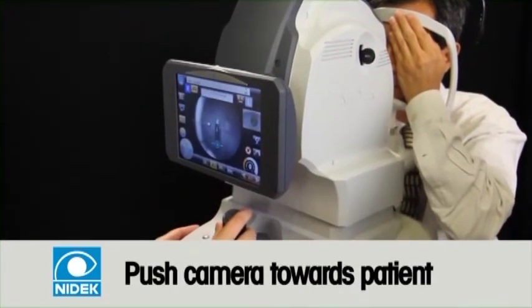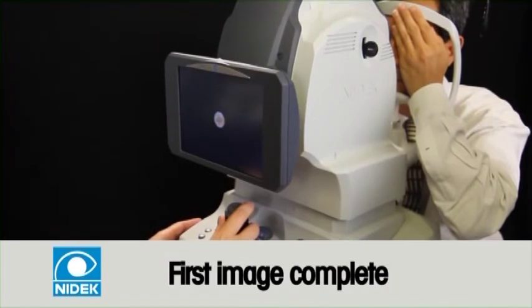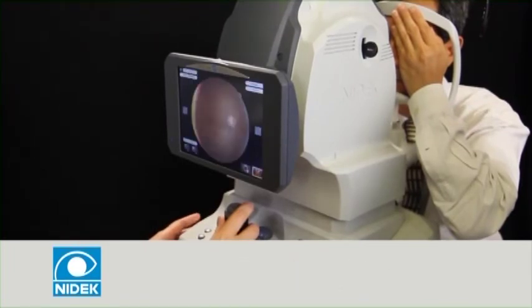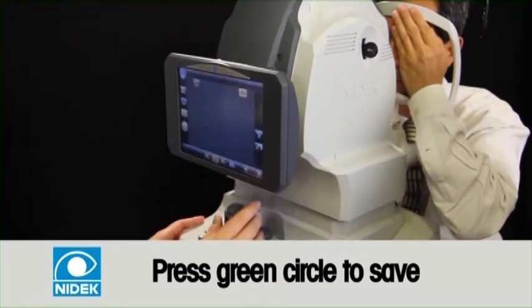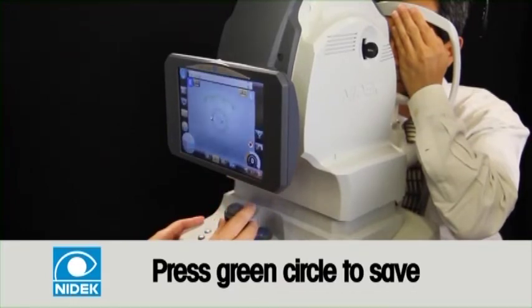Have the patient open wide while not blinking or moving. The camera's automatic functions will take over and the image will be captured. If needed, the operator can press the capture button on the joystick to override and capture the image.